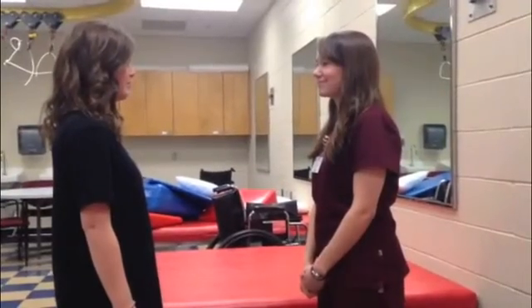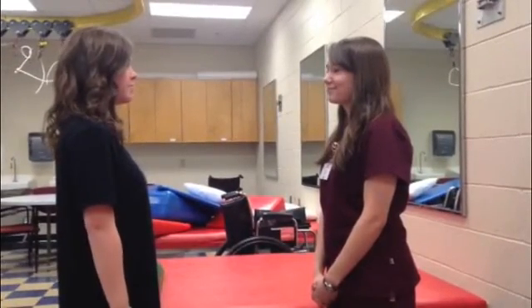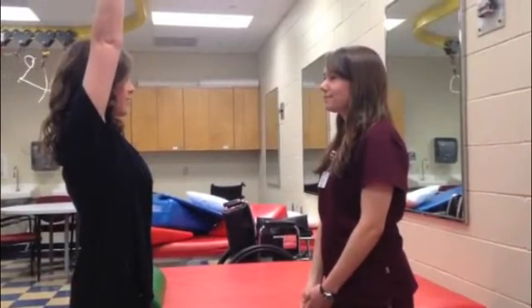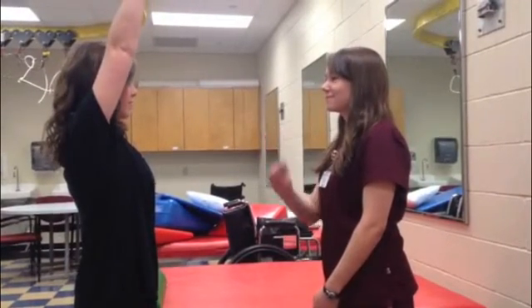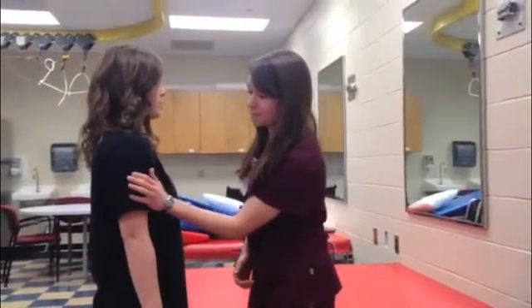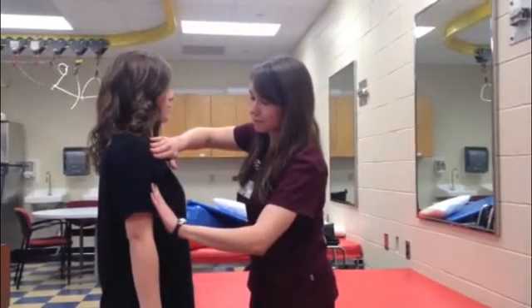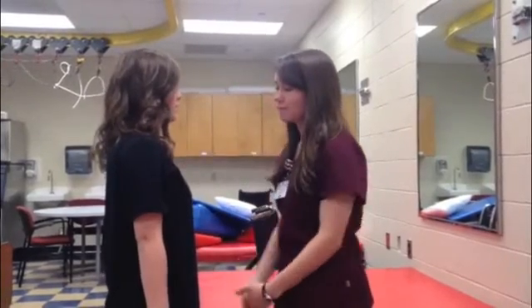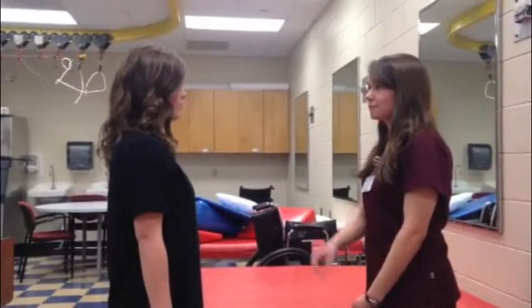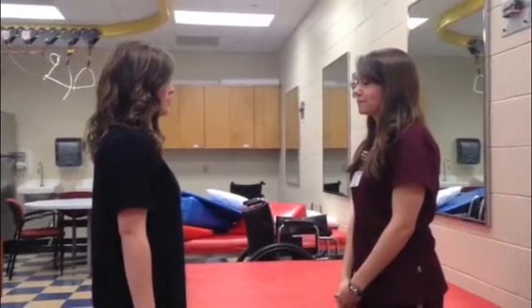To measure shoulder flexion, the patient should be standing upright. Ask the patient to actively raise the shoulder forwards. If they can perform this motion against gravity, they would receive a grade of 3 or fair. If the patient cannot move their limb at all, palpate the muscle belly of the biceps brachii or the anterior deltoid to feel for a contraction. If a contraction is felt, the patient receives a grade of 1 or trace. If there is no muscle contraction at all, the patient receives a grade of 0.